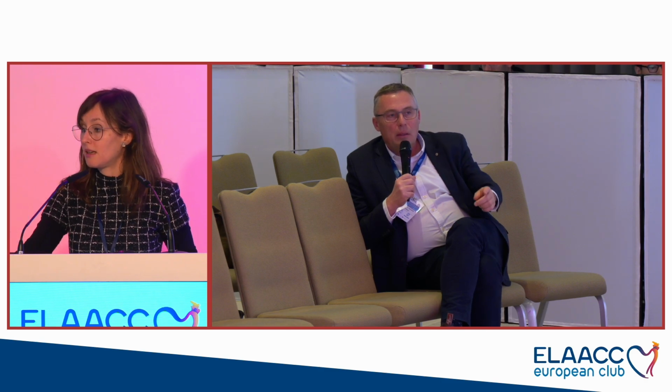Yeah, and another question, because Philips approached me this week with a 3D TEE probe. Have you got any experience with that 3D TEE probe? Because that one was from GE, as I understand. And what about Philips? Philips is good as well? I don't know because I didn't test it, but in the next months we are going to have it just to test it and see how it works. But if it's similar to this one, I think it will be great.